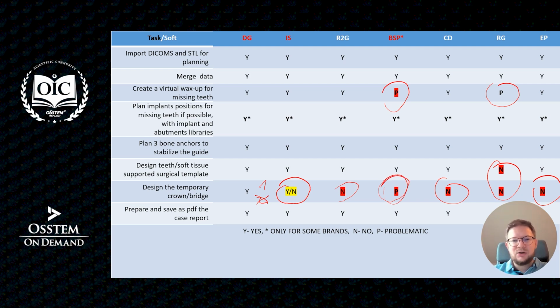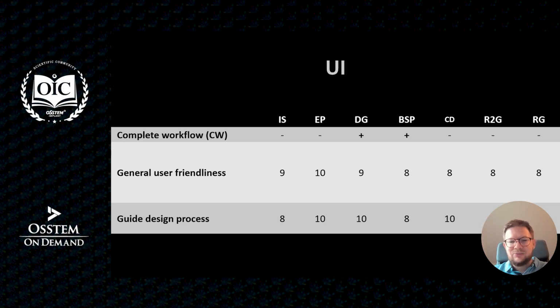So we asked ourselves a simple question: is it generally user-friendly? The software was evaluated quite high, on a scale from 1 to 10. It's mostly 8, 9, 10. The design process of the guide was also evaluated quite nicely.